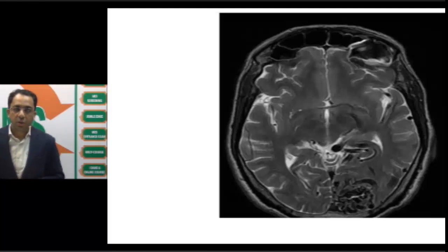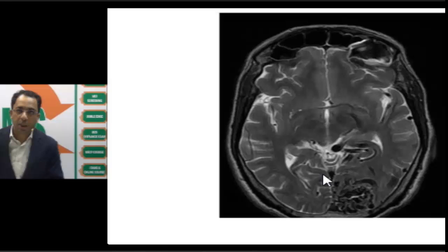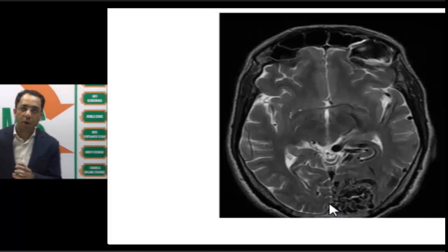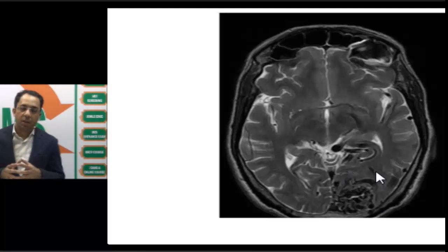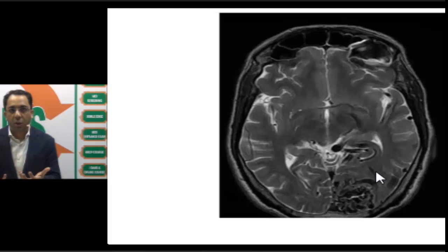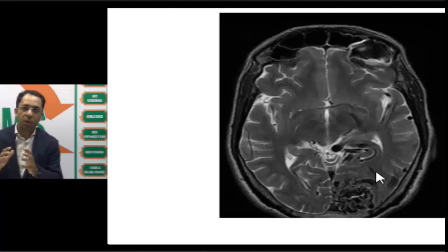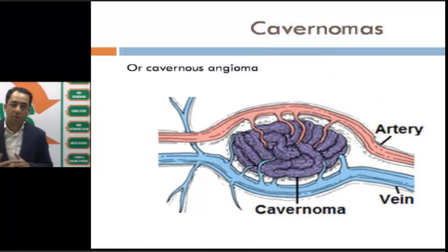On a T2-weighted MRI image of the brain, look at the left occipital area — you will see multiple serpiginous areas of flow void, like a bag of worms. High-flow blood appears as a flow void on MRI. You can see multiple serpiginous flow voids in the occipital area with feeder arteries coming from the posterior cerebral artery (PCA), consistent with an occipital AVM. The T1-weighted appearance depends on the presence of slow flow, surrounding hemorrhage, edema, or gliotic changes. Multiple serpiginous flow voids are typical of AVM.